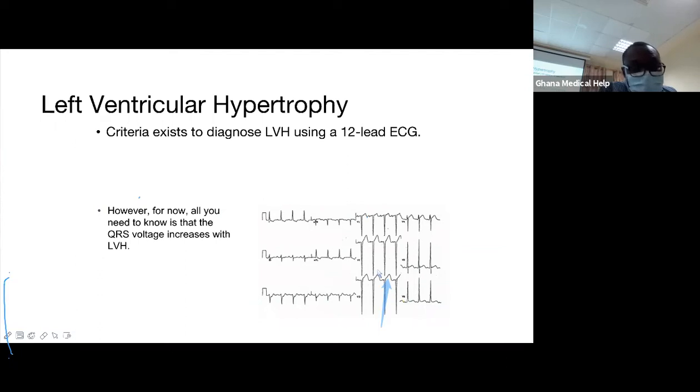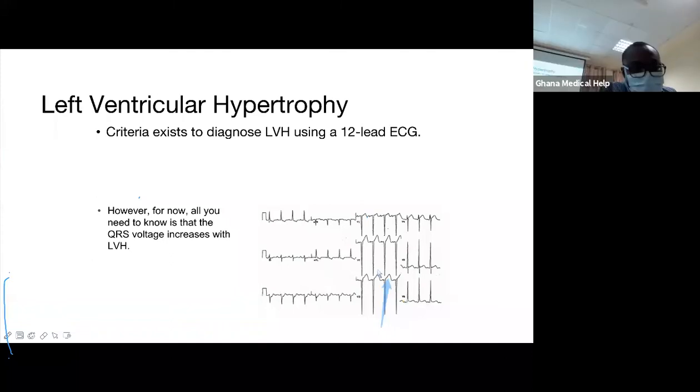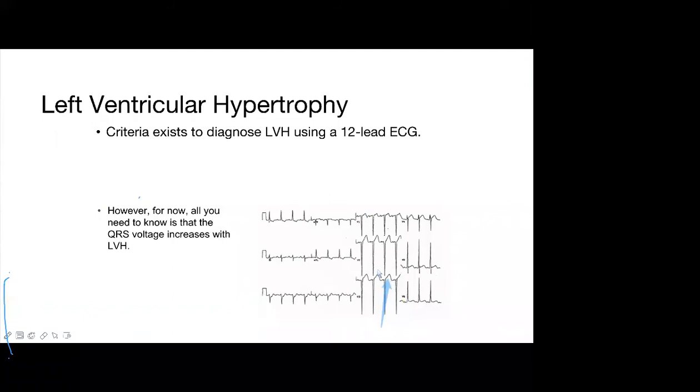Someone is asking a question. There's an interesting question in the chat, so let's take a look at it. Just read it out so that we'll hear. My question is, do the ST segment abnormalities in relation to myocardial infarction also capture infarct of the atrium or the ventricles only, since that section of the ECG is recording information from ventricular electrical activity?